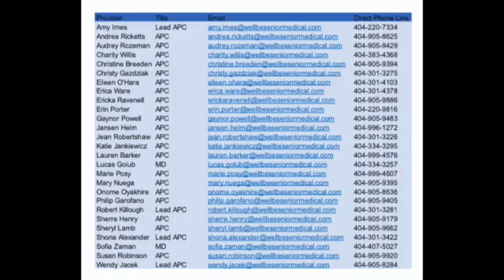7. Finally, don't forget to file a paper copy of the ECG under the red Test Results tab in the patient's purple Wellbe folder. And lastly, attach the PDF copy of the patient's ECG record to your EPCR.